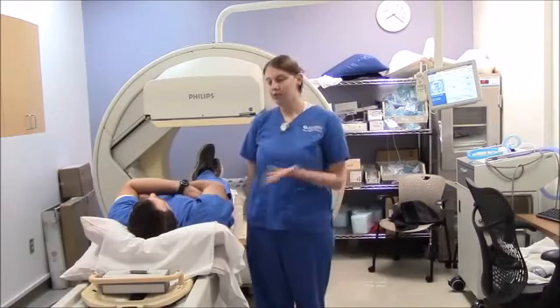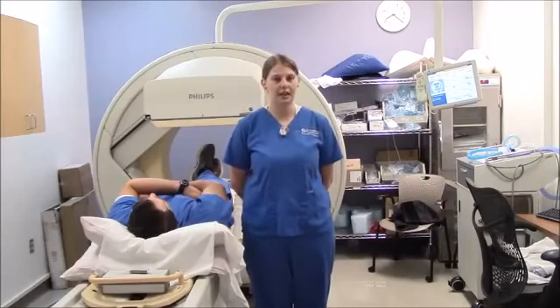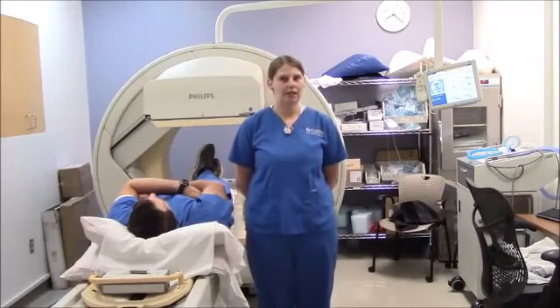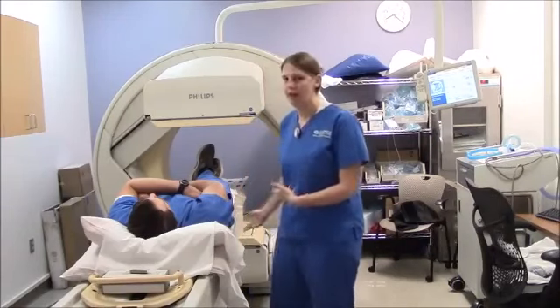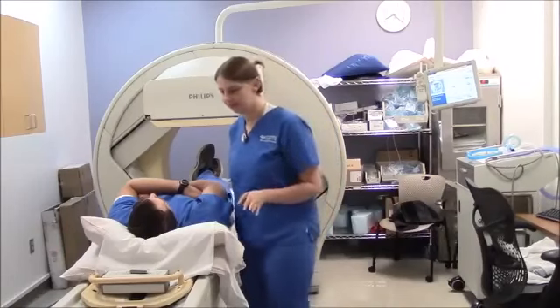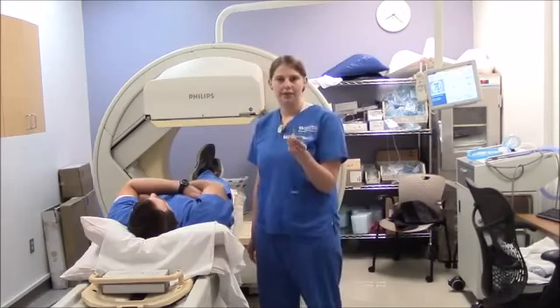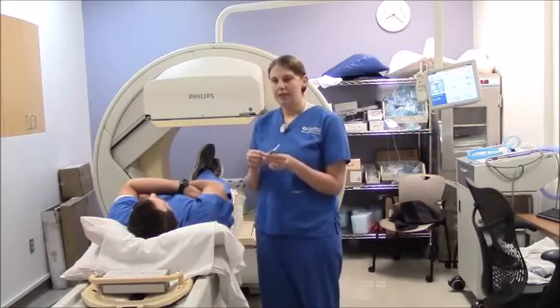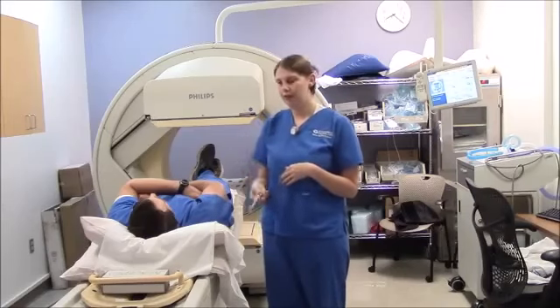I have my patient Jake here, who has just completed his ventilation portion of the test. So now we'll move right into the perfusion. As you can see, the patient is still supine. You want them to be laying down while you give them the injection. It's a small amount of a radioactive tracer. It's actually very small particles, so you want to make sure and agitate the syringe before you inject it.